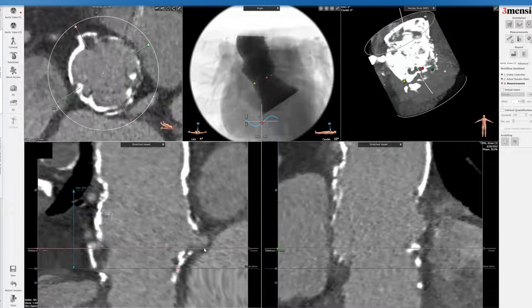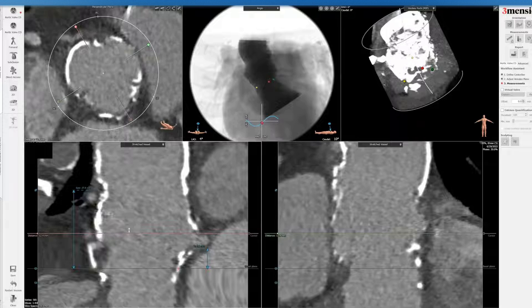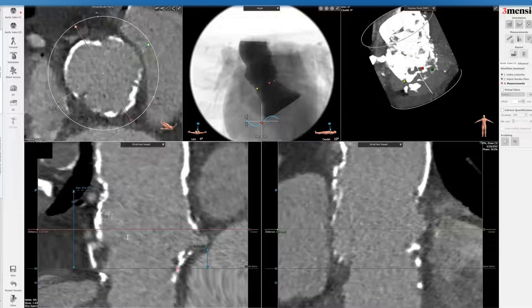The left main coming off this one in this case is a little bit lower than typical, but sometimes it's hard to mobilize the left main, so that may be the reason. I'm going to divide the sinuses by half, and you can see that here.